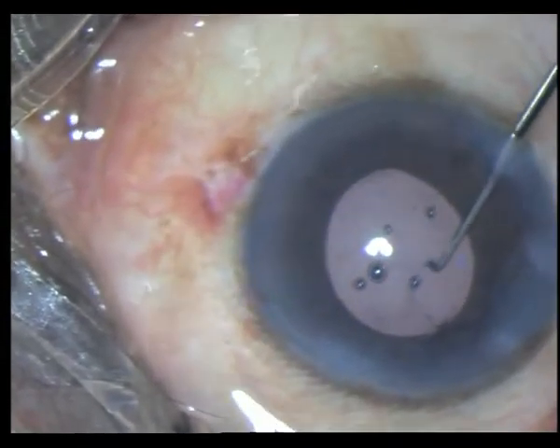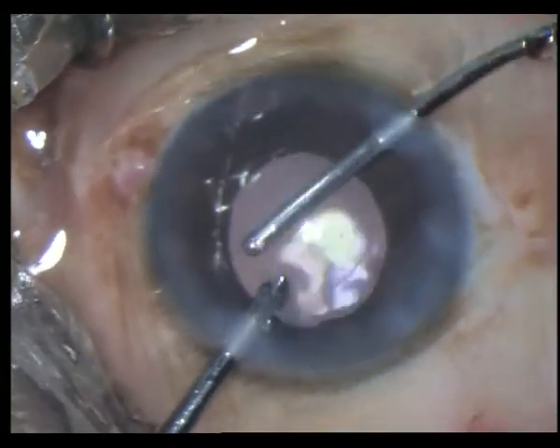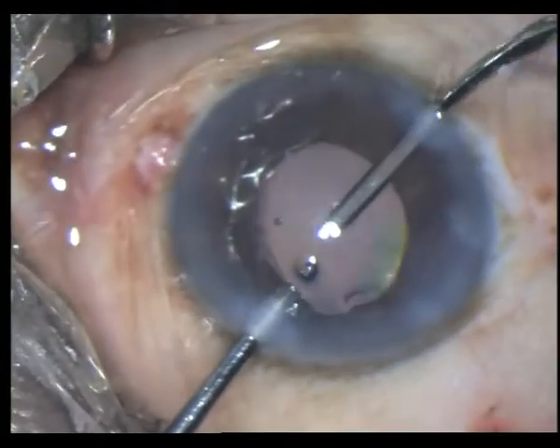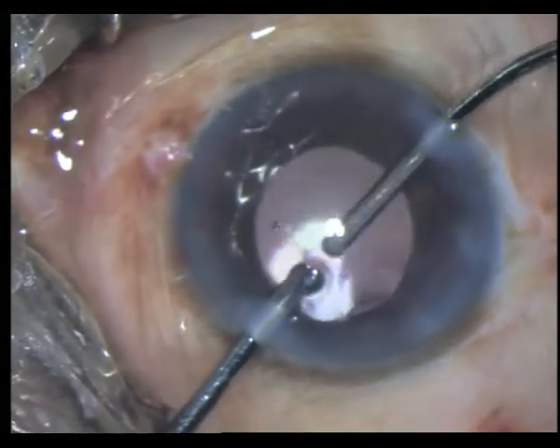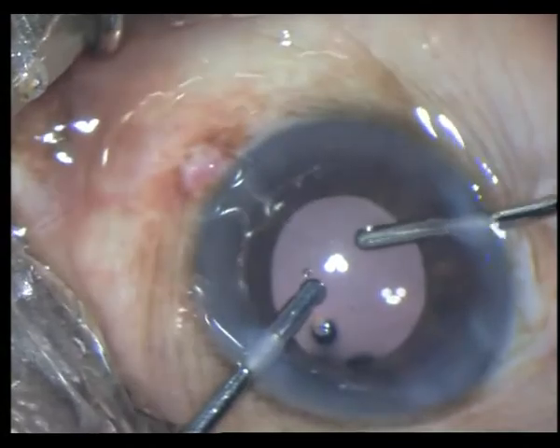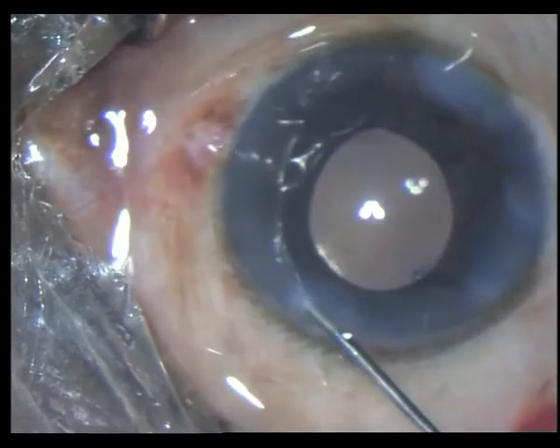In the final stages I aspirate all the HPMC, and if the lens happens to come out I capture it by just tapping on the lens. I then conclude the surgery by hydrating the wounds and injecting my intracameral.